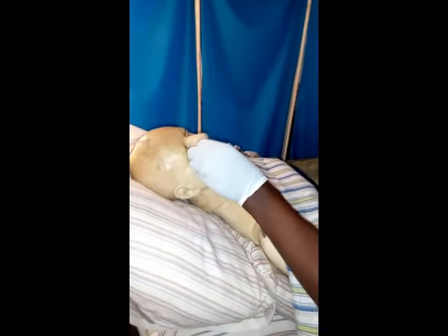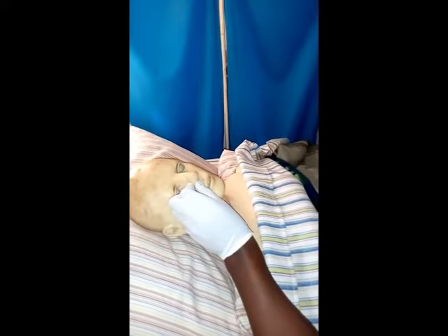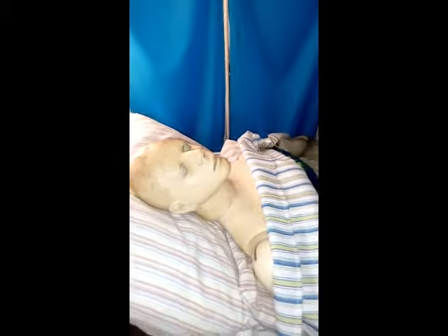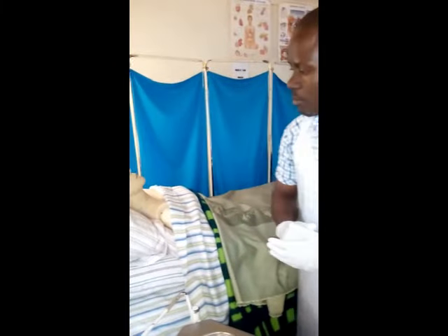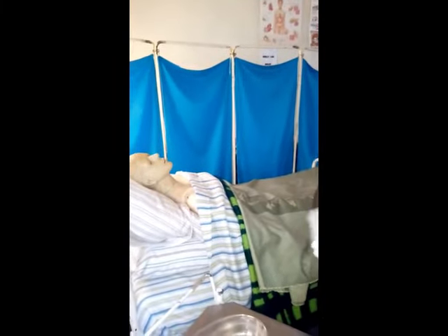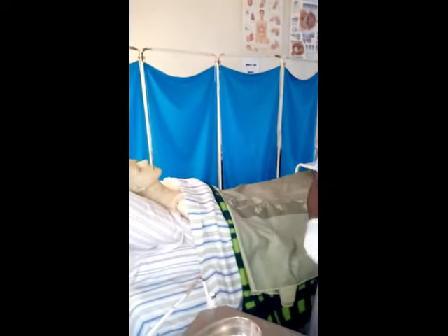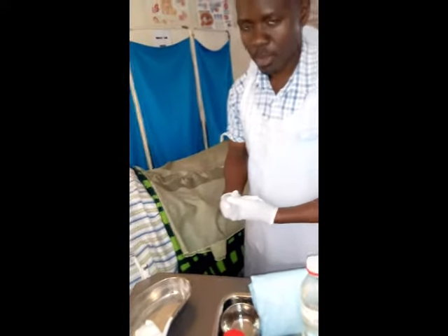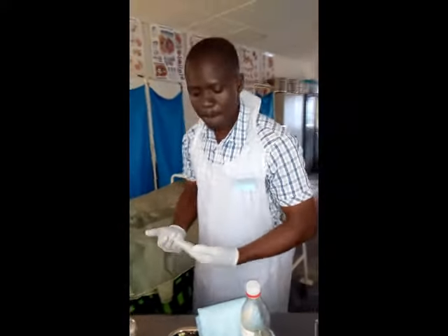So we occlude also the right nostril. Mrs. Mwape breathe. Mrs. Mwape is breathing, meaning the left nostril is also patent. So at this moment, since both nostrils are, I can say, equally patent, we need to go for the left nostril. Okay, they are equally patent. So then, these gloves, if you see that they're dirty, after having done that, you can discard them. Okay. So now let's measure.